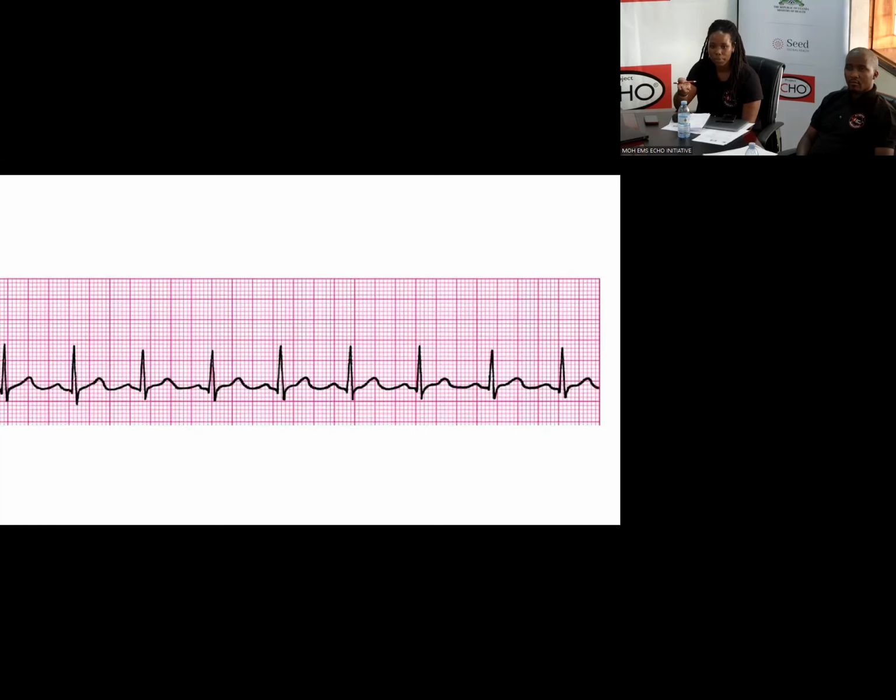So this is when we typically do a 12 lead. If you notice some elevation when you put them on the 4 lead, then you should probably be pushed to say we should probably do a 12 lead. But we can't determine that someone is having an infarct by just looking at one lead. So the ST segment is typically for diagnosis purposes, and your T wave also will give you diagnostic information. You don't necessarily need it to determine what kind of rhythm you're looking at, just on the basic level.